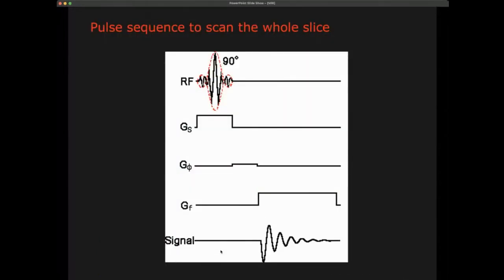That's actually illustrated here partially. So this is how magnetic resonance sequences are plotted or designed. What I do is I switch on the slice selection, so the Z gradient. And while this is on, I put on the RF pulse, the 90-degree RF pulse.